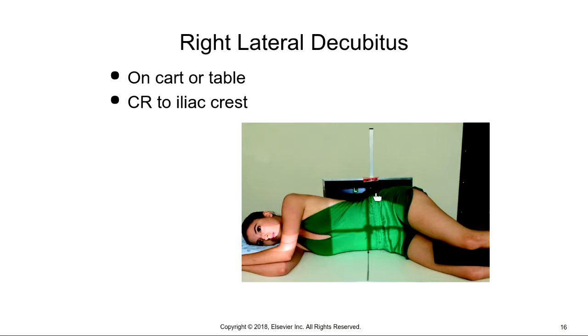The technique for this is 90 kVp at 3.3 mAs, because it's double contrast. I mean, there's not only barium, but there's also air. So the patient would lie on their right side. You have a horizontal beam because it's decubitus, and you're also looking for an air fluid level. Your central ray is at the level of iliac crest and midline.